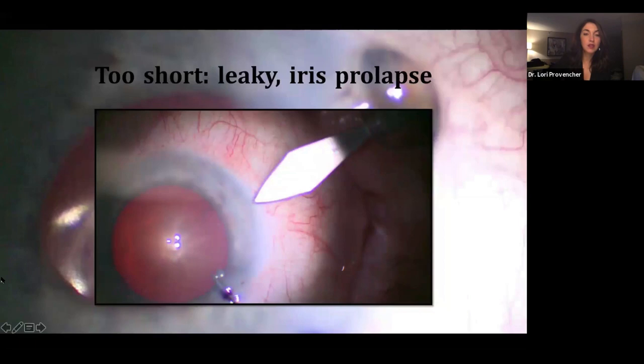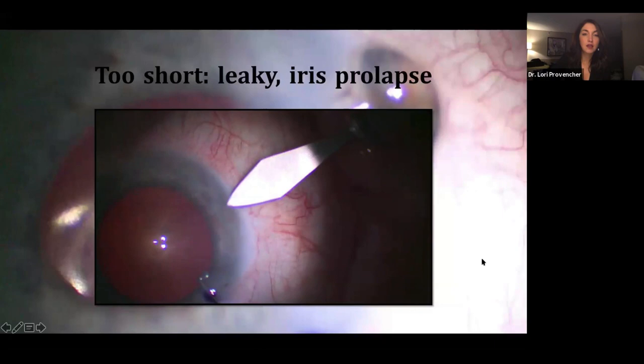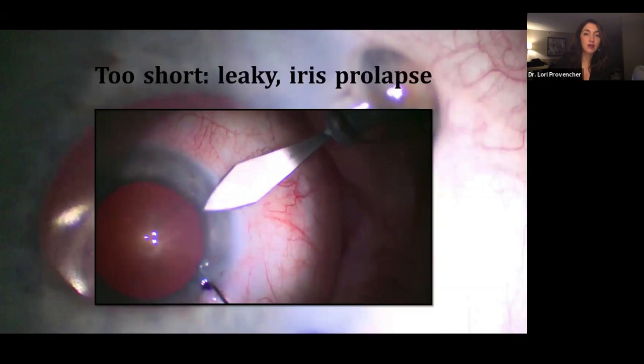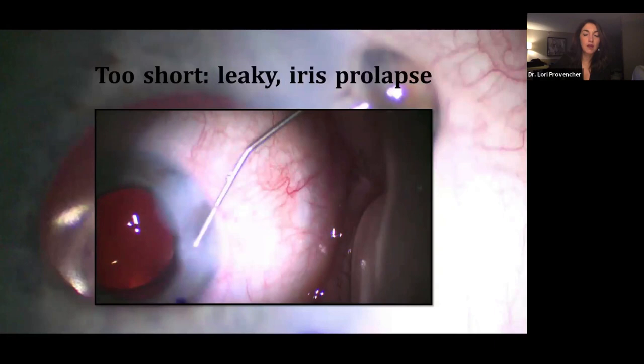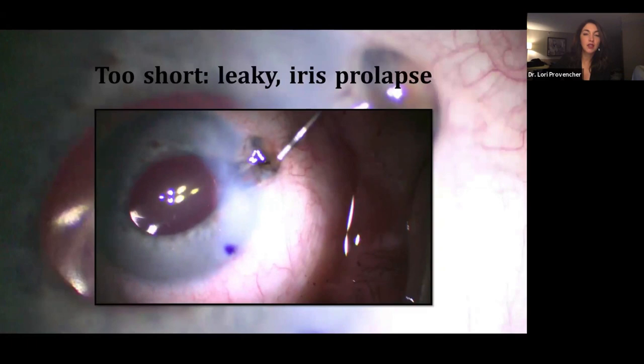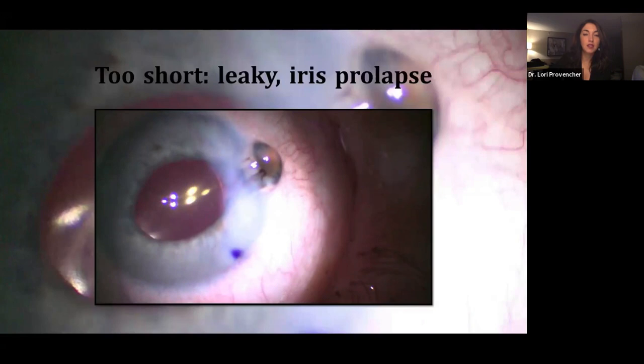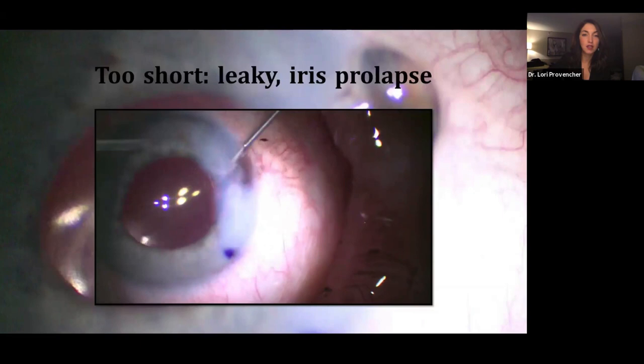This is a quick video of a short wound. You'll see here that I am going in, and I'm really entering already right there. Toe down just a little bit to enter. It looks okay. We get through the case. But as I'm closing up here at the end, probably hydrating more than I need to because I know the wound's on the short side, the iris prolapses out. And this isn't that big of a deal, but it is annoying, and that patient's probably going to have some transillumination defects right there.